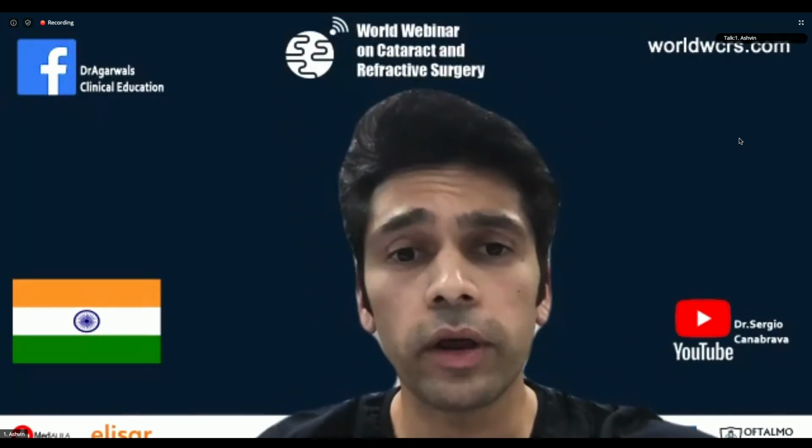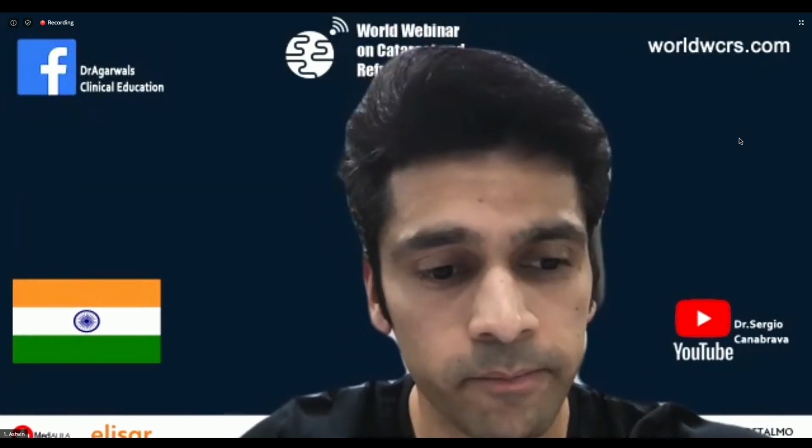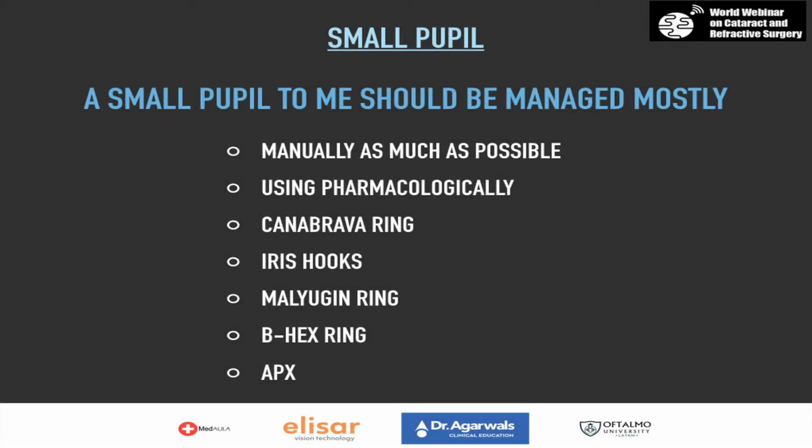Let's do the polling question. Can we have the polling question on, please? A small pupil, to me, should be managed mostly manually as much as possible, using pharmacological agent, Canabrava ring, iris hooks, Malyugin ring, the B-HEX ring, or the APX. And we have 15 seconds to answer this, guys.